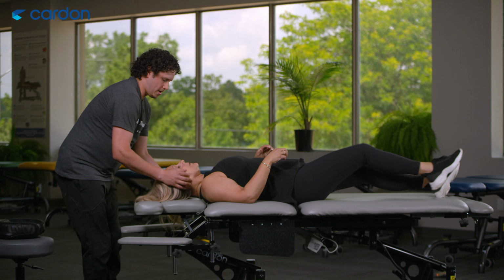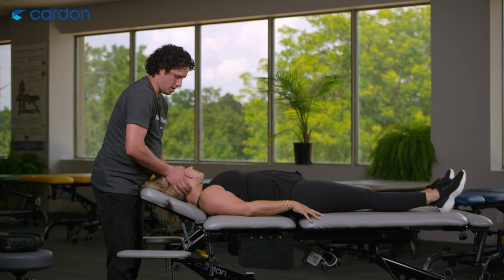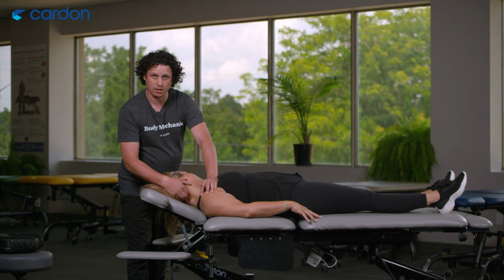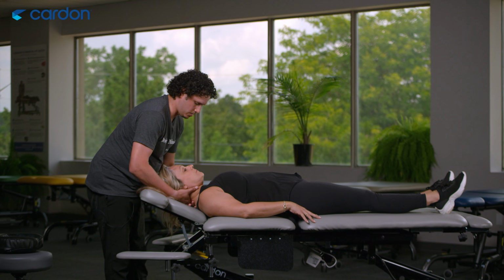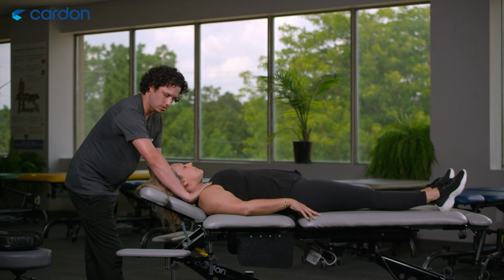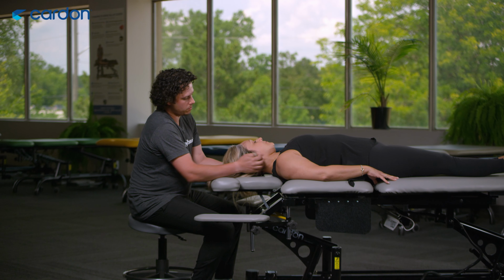Again, if you're a chiropractor and you're looking for something too, you can raise the headrest up as well, or even just do some stretching in through here. I can bring the head up further. You can come in and do your adjustment work that you need to with the headrest in that position as well. Okay, so now we're going to come in and do some neck work.